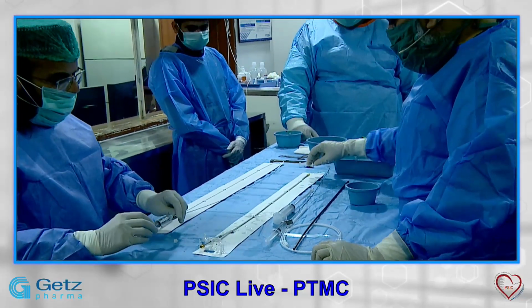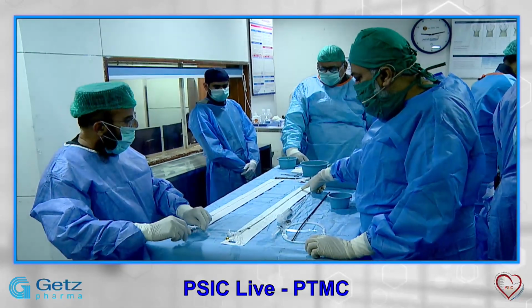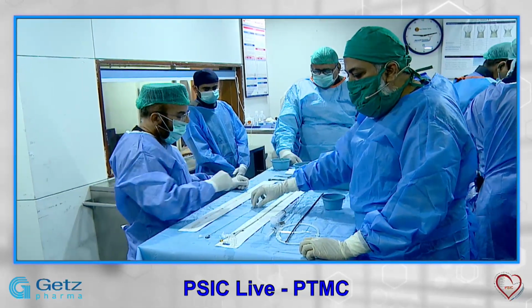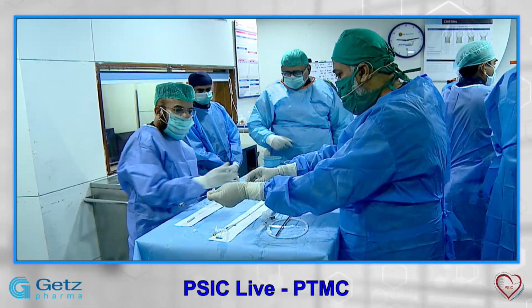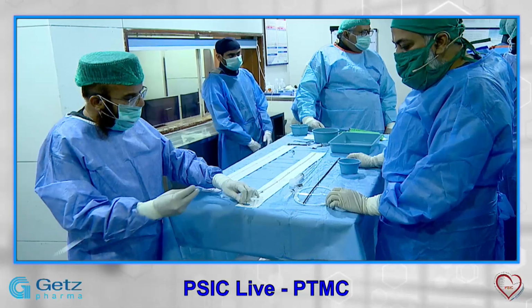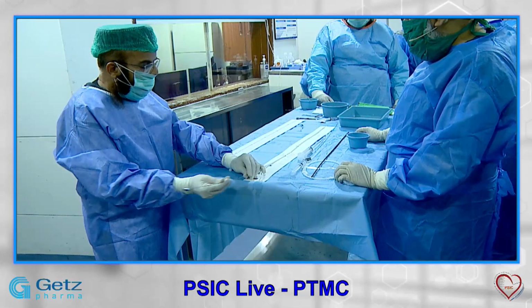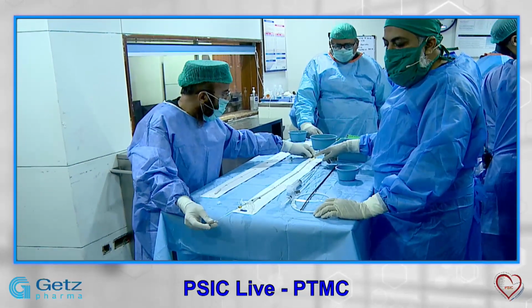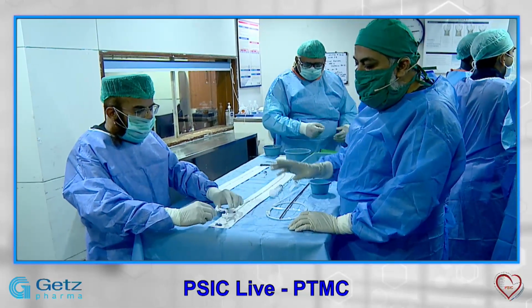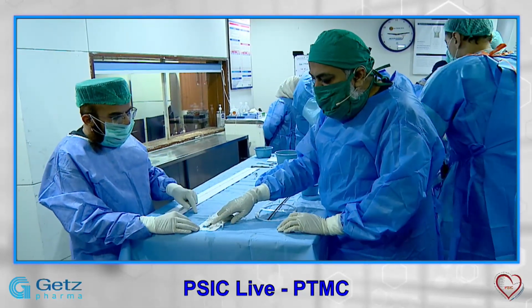Now this is an important part, because this balloon is a soft balloon. In order to cross through the skin and through the septum, this balloon needs some support. For this support, we have this straightener. This straightener will be supporting the balloon when we are taking it through the skin and crossing the septum. The next part of this balloon is this golden hub.